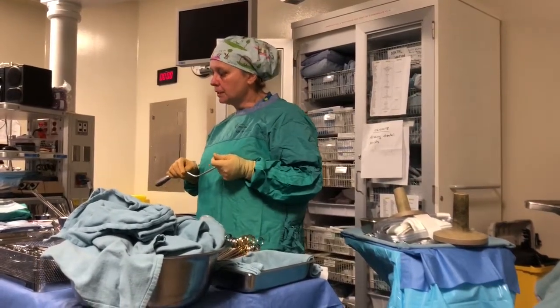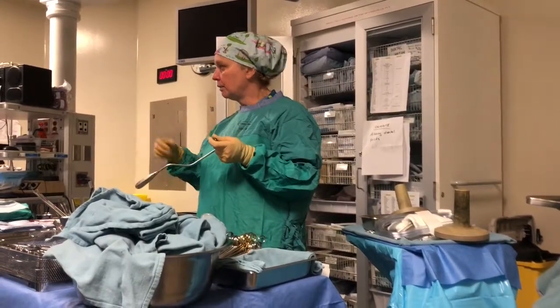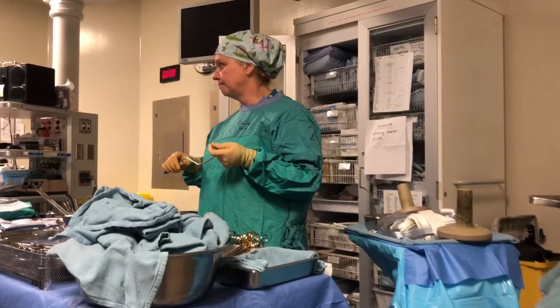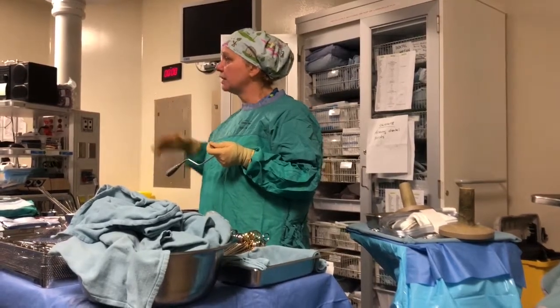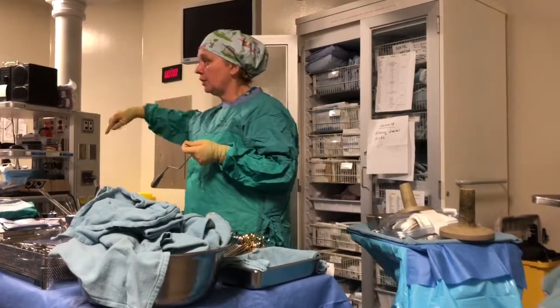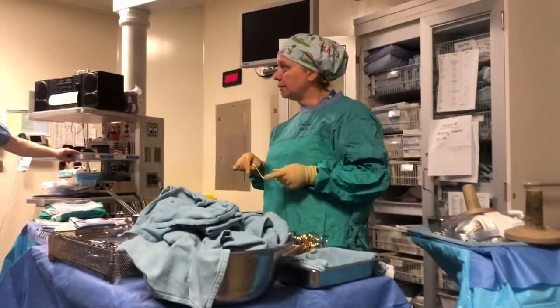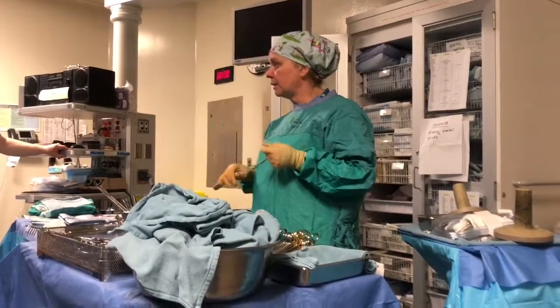So my suction, actually, I get a different type of suction, and one end goes to the person that's looking after the cell saver, right? And so every time they use that suction, it goes up into her, and she's got a little machine, and it cycles the blood, and then they just make a bag, and they give the person the blood back.